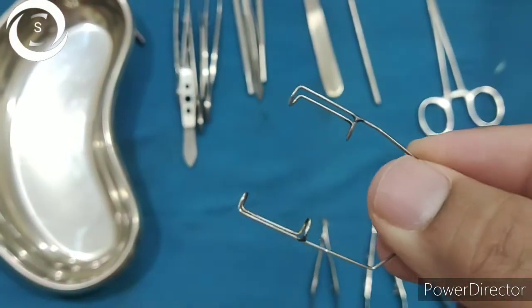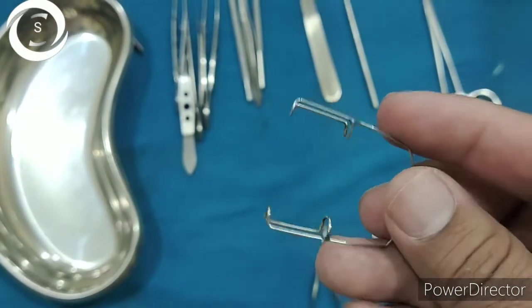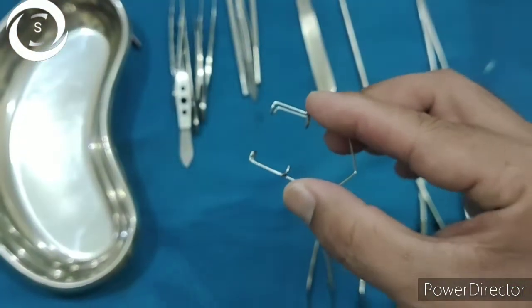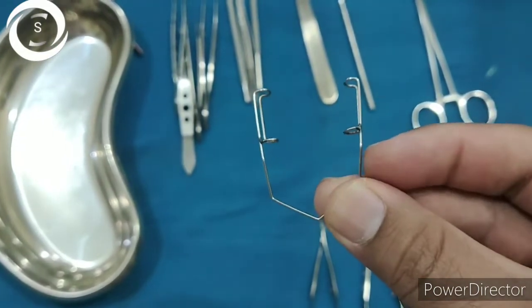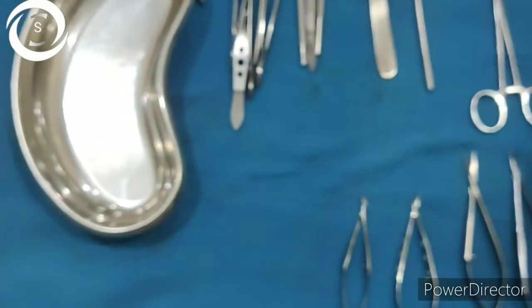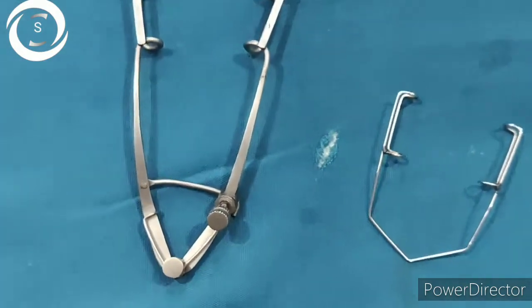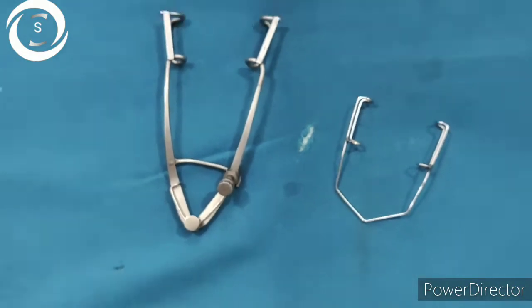This is the eyelid speculum. Its function is to retract the lids and hold the eye open during surgery. Wire speculums are lightweight and transmit less pressure to the eye, so they are used in intraocular procedures. Large full-bladed rigid screw speculums are used for strabismus and extraocular surgeries — you can see a large screw speculum placed on the left side.